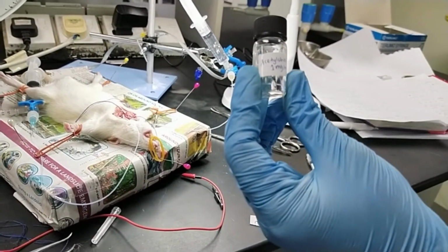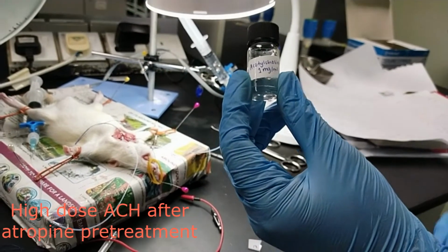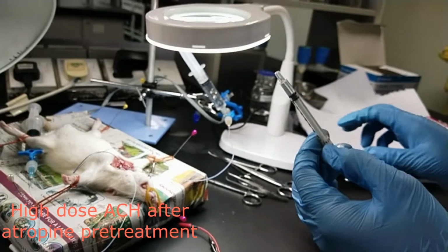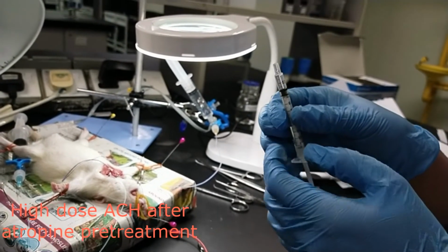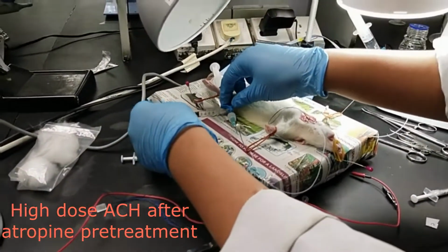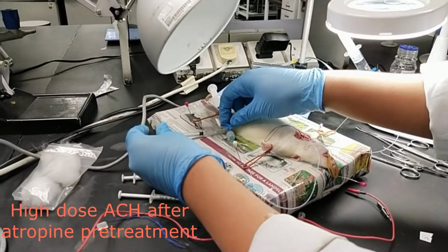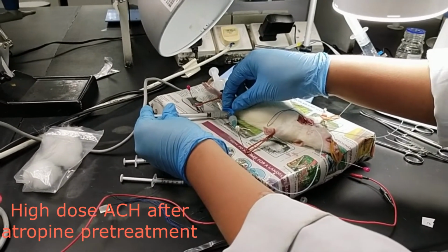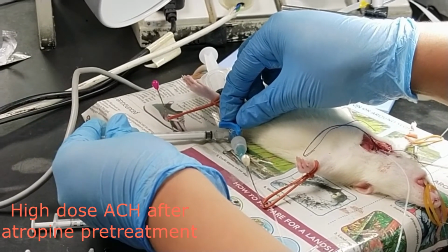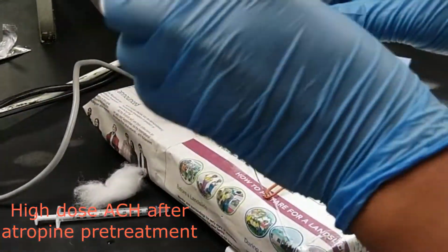Now we're going to proceed by using acetylcholine, but this time we're going to use the high dose injection. The concentration for the acetylcholine is 1 mg per ml, and the dose for the injection is 1 mg per kg. Based on the calculation, we need to inject 0.2 ml of acetylcholine into the system. After the injection of acetylcholine, we need to inject 0.5 ml of normal saline as well.